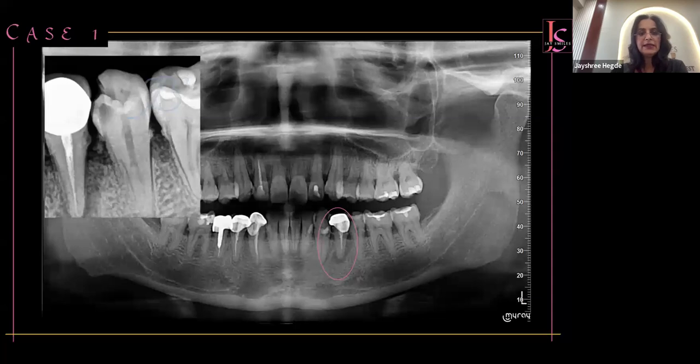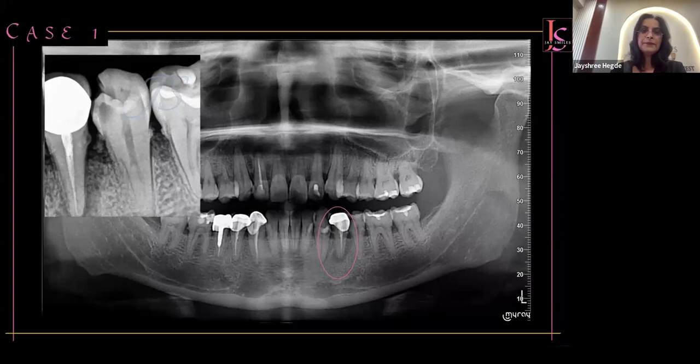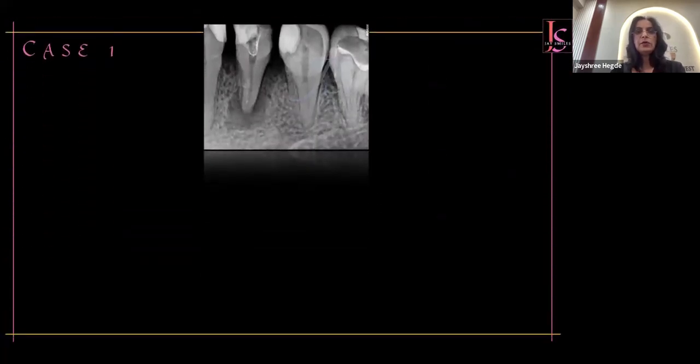And you can see here, even on the left side, all the root canals, by whoever did the root canal, one dentist, are failing. You have 4, 3, 4, you have 3, 3, 4, 3 and 4, 5 failing. You have 1, 2 failing. So all the root canals are failing. That means there is an issue with their protocols of treatment, which needs to be changed. So we removed all the contents of the canal.